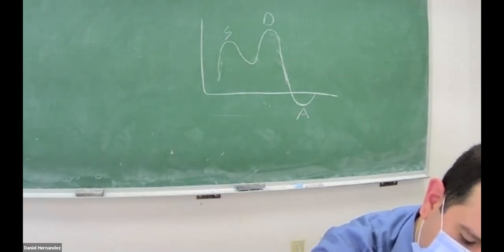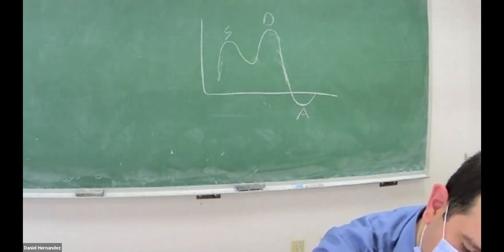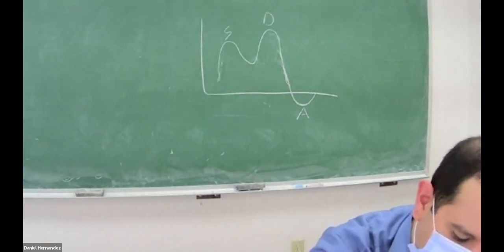The sinus of Valsalva aneurysm in the right coronary sinus usually protrudes into the left atria, left ventricle, right atria, or right ventricle. Right atria? Left ventricle? Right atrium. A sinus of Valsalva aneurysm.